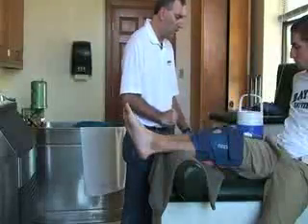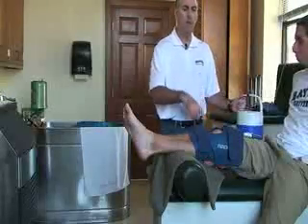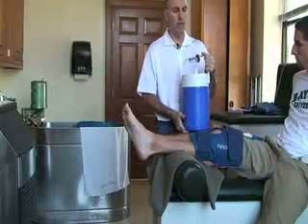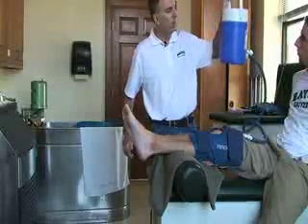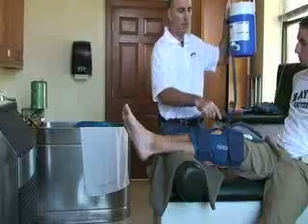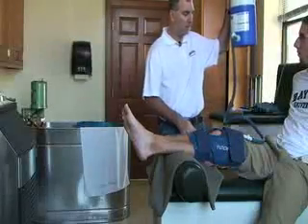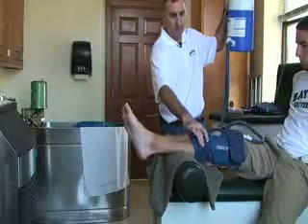In order to get the ice water into the attachment, we open the air vent to let some air into the bucket, then raise the bucket high enough so that the water runs from the bucket down into the cryo cuff. This should be filling up with the cold ice water you just made.